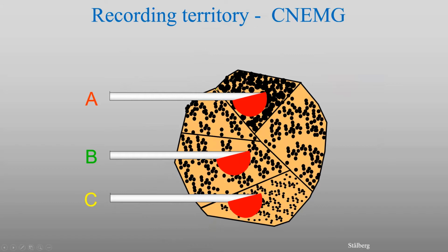Here's again the repetition of this. We have a motor unit here during reinnervation where some corners can be heavily reinnervated. Other areas can even show fiber atrophy, smallness of fibers or loss of fibers.